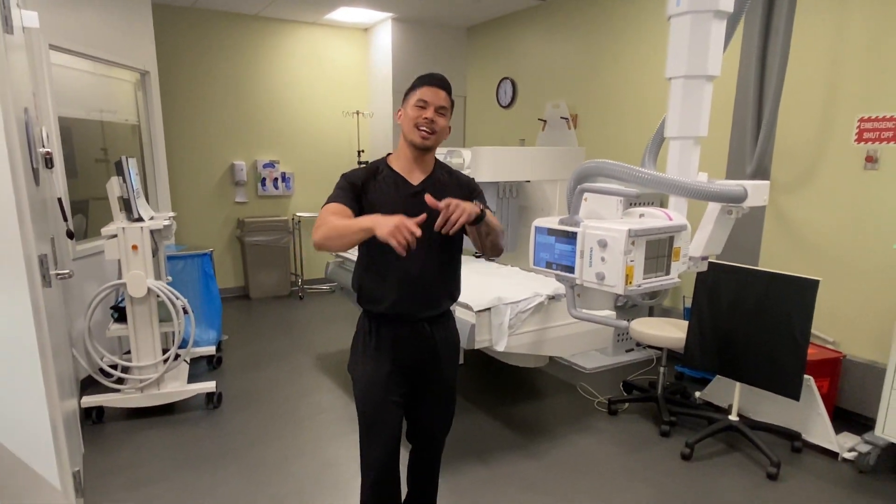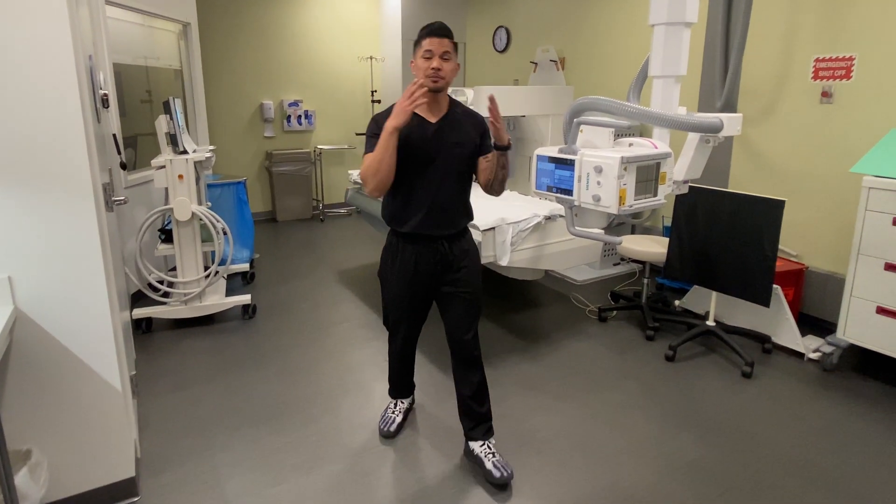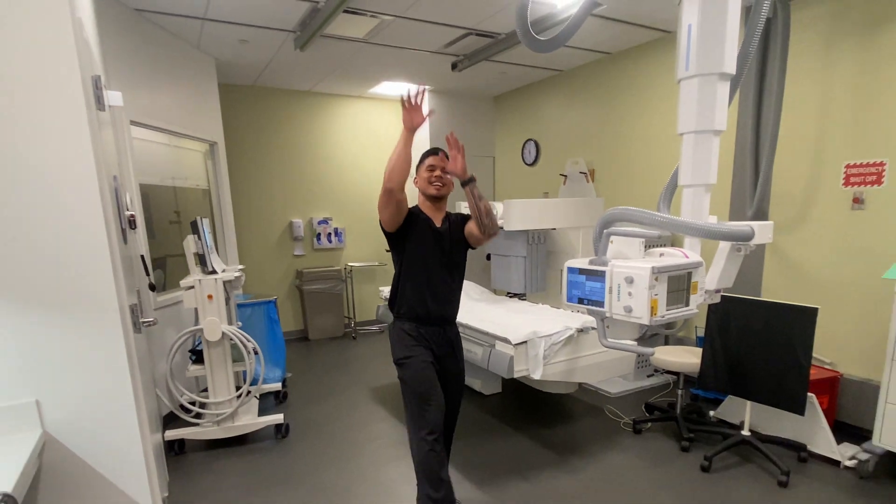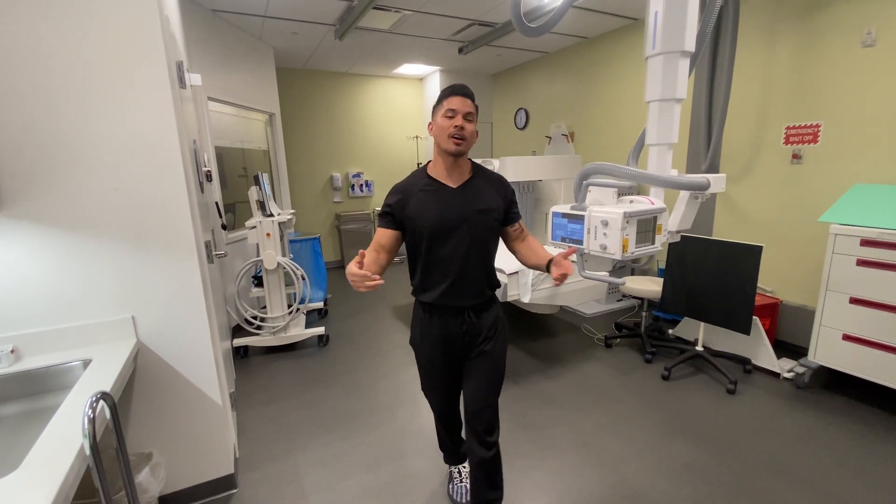What's going on YouTube? My name is Ray and I'll be taking x-rays. Welcome to my turf, my court, my playground. What do you say we work on some positioning? Let's go. Let's get it.